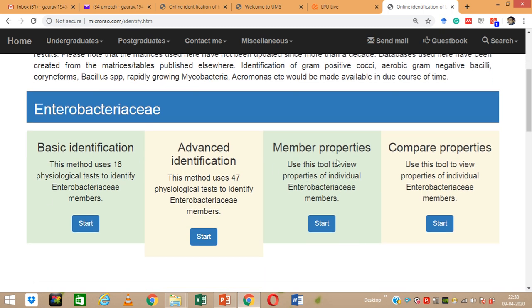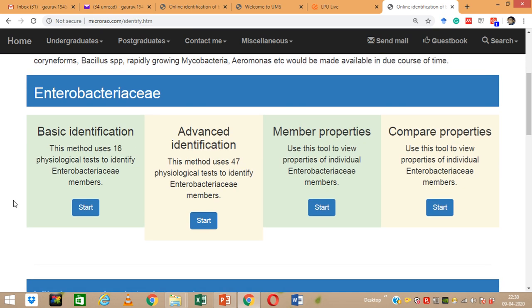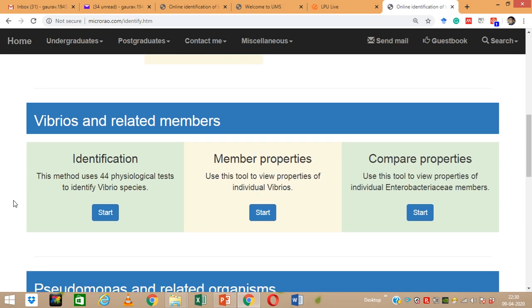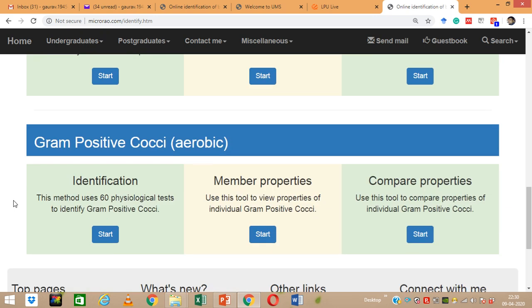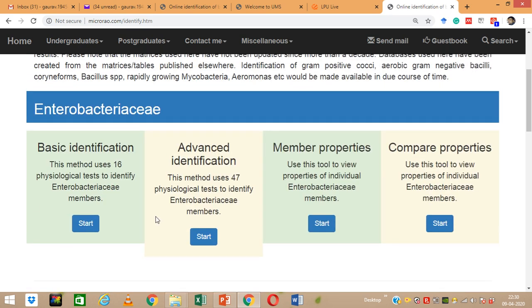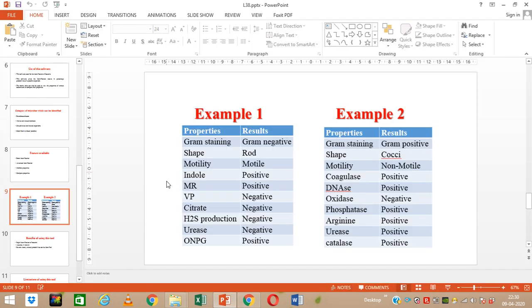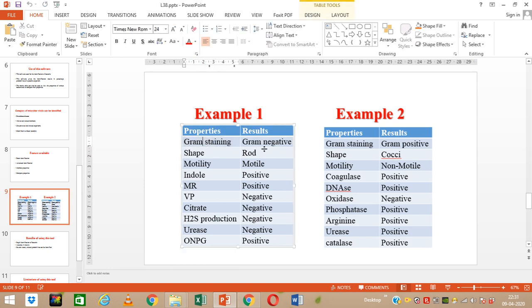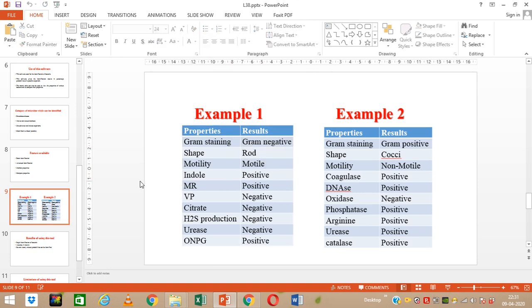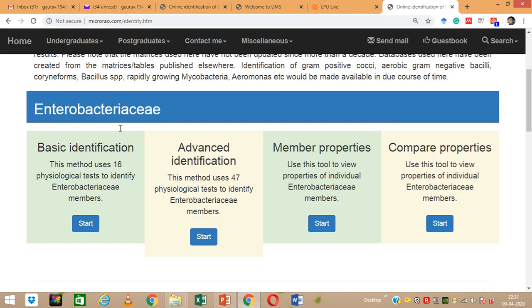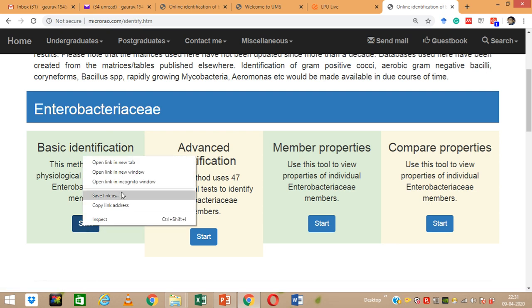On the website you can see Enterobacteria along with all four options: basic identification, advanced identification, member properties, and compare properties. Based on our sample data — Gram staining result is Gram negative, rod shaped, motile — these usually indicate Enterobacteria members. So we will choose the basic identification module for Enterobacteria in this case, and I am opening it in a new window.